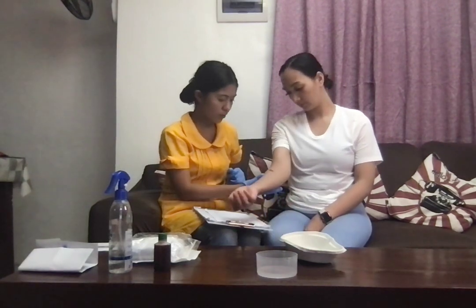After that, I'm going to inspect the wound site for its size, appearance, and drainage. And I'm going to measure the wound size using a ruler, like what I've done earlier. And I'm going to assess if any pain is present and check the status of sutures, adhesive closure, staples, and drains or tubes if present. And I'm going to note if there are any problems to include in my documentation. Ma'am, assess ko lang po. Na-check ko naman na po yung size po niya and location.